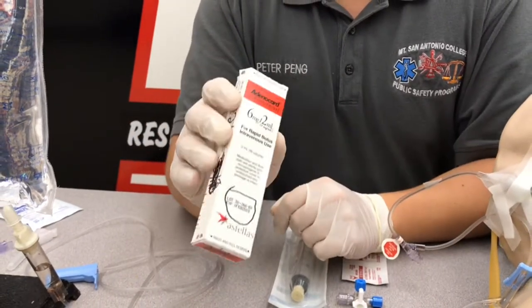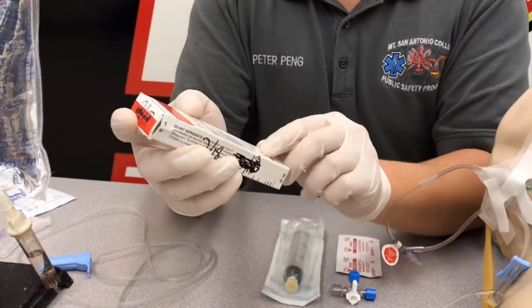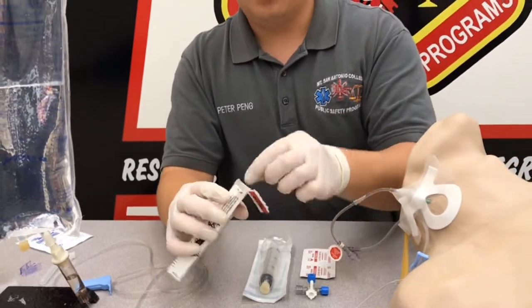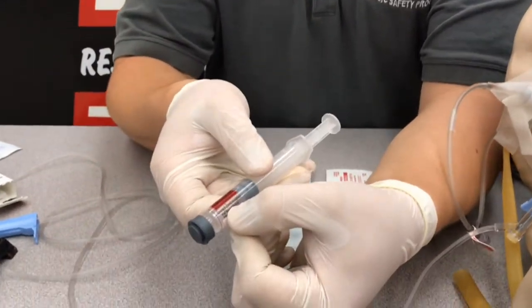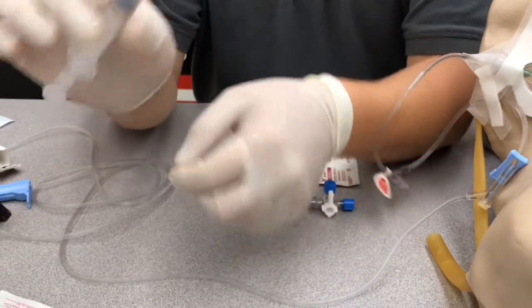The integrity is good, the package has no damage to it, and the expiration is February of 2018. We'll pull this out and check it one more time — it's adenosine, six milligrams in two mLs, expiration February of 2018, and this is all intact.